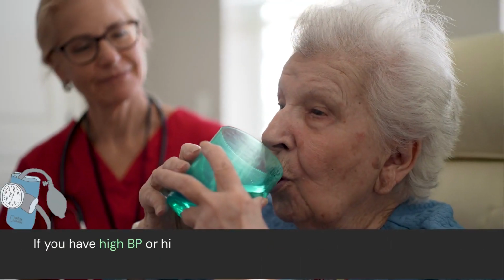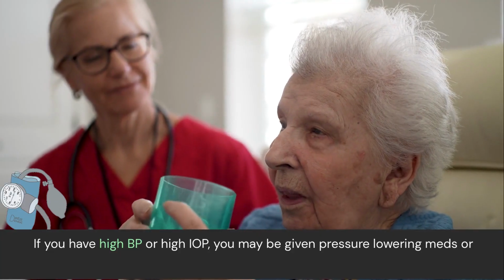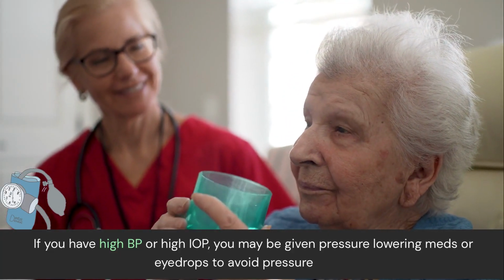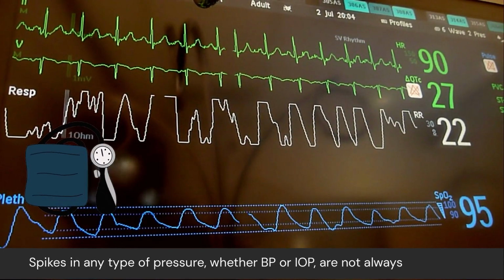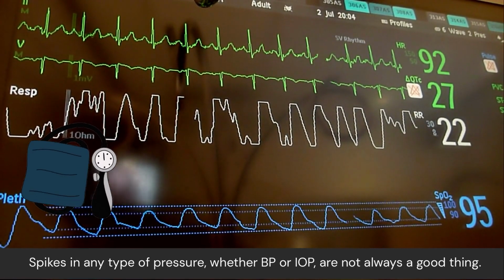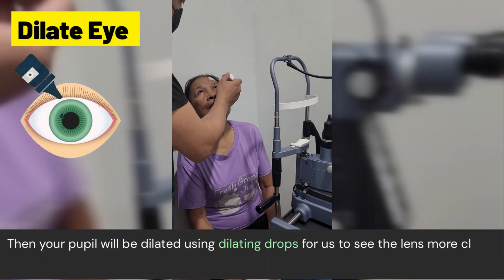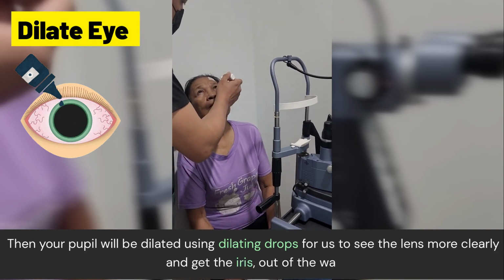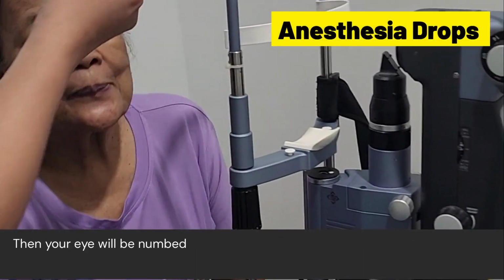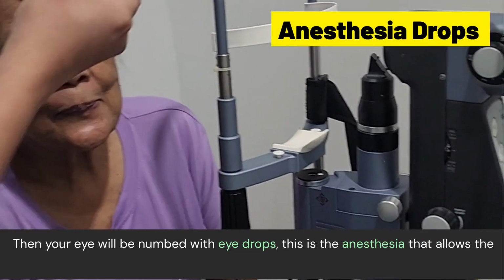Now, if you have high BP or high IOP, you may be given pressure-lowering meds or eye drops to avoid the spikes. Spikes in any type of pressure, whether BP or IOP, are not always a good thing. After that, your pupil will be dilated using drops for us to see the lens more clearly and get the iris out of the way. Then your eye will be numbed with eye drops, and this is the anesthesia that allows the procedure to proceed without pain.